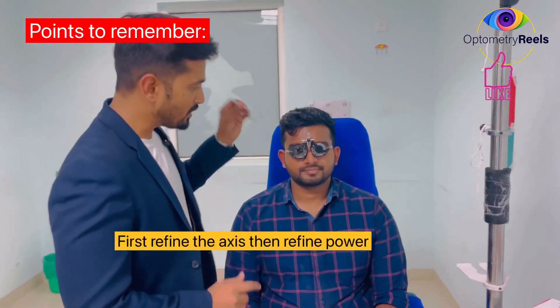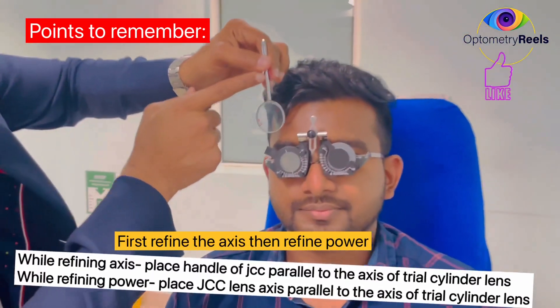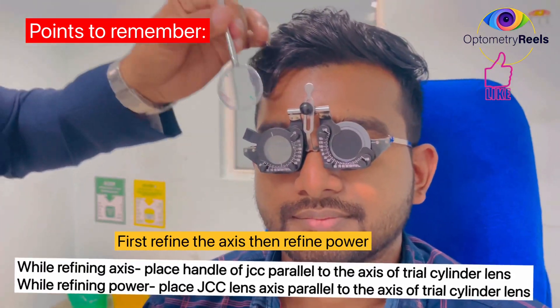We did a fogging and we have got minus 2.5 as the base sphere, and the cylinder obtained is 1.75 at the axis of 100. So I will be using this JCC to refine the axis and the power. First we have to refine the axis.